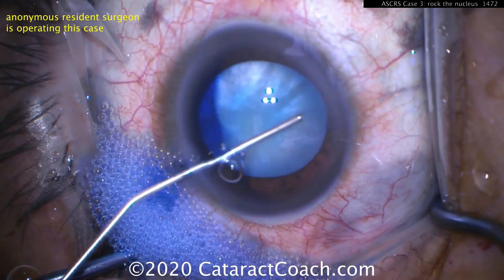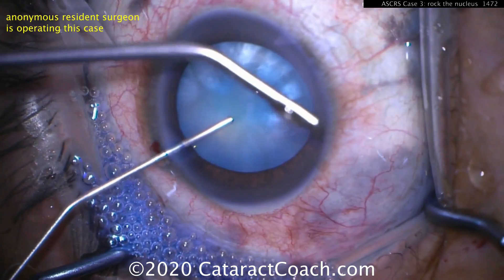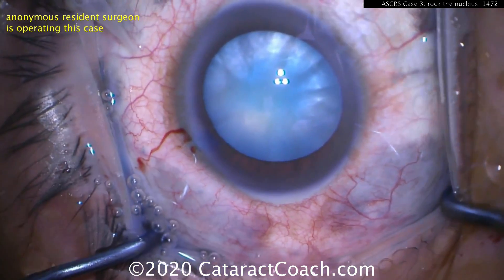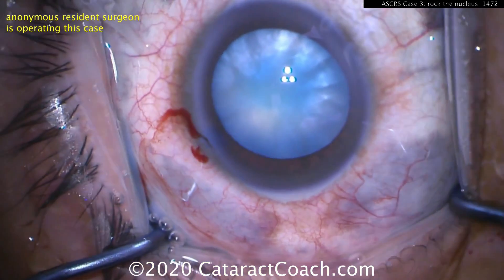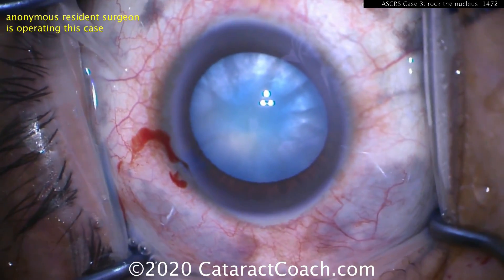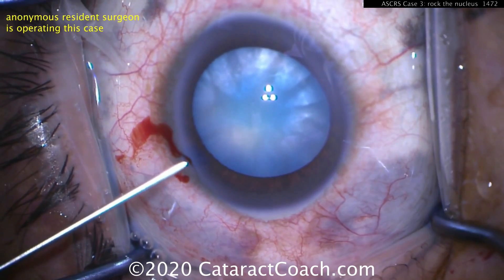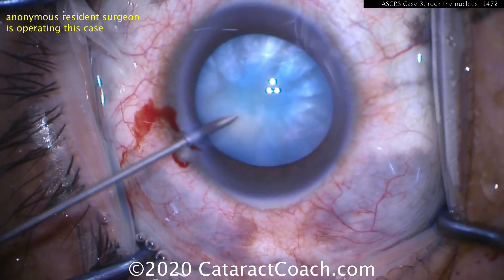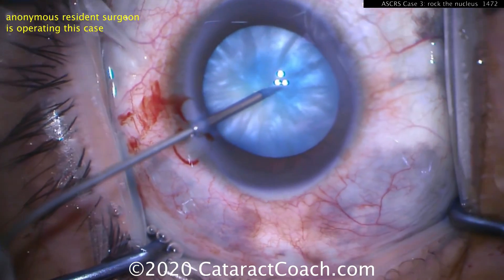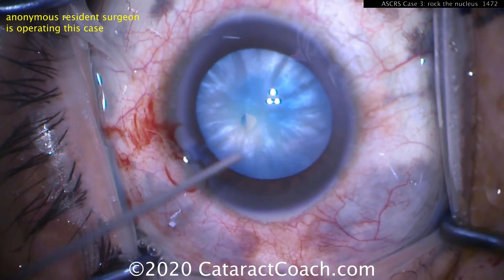Let me tell you what I mean about rocking the nucleus. Here's another intumescent white cataract managed by a resident. We're checking the AC pressure — we want to get that AC pressure high enough. If you need to, put more viscoelastic, but get the pressure in the AC higher than the pressure in the bag. That's almost a pretty firm AC. So again, injecting now — going in with the needle, sucking out some of the liquefied lens material.